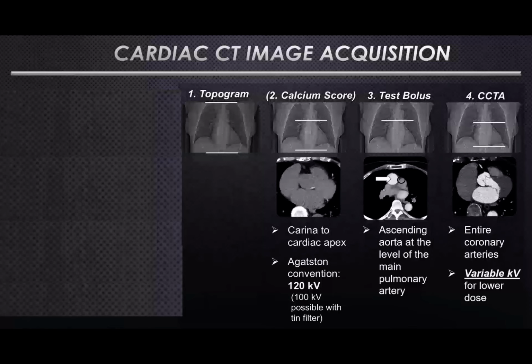So don't narrow this window too much here, because when the patient feels this warm sensation during contrast media injection, they will probably breathe a bit differently than in the topogram and calcium score, just because they are maybe a bit confused by this sensation. And we had cases when we were too aggressive with dose reduction that we cut off a tiny branch of the LAD, for instance, and you don't want to run into that.